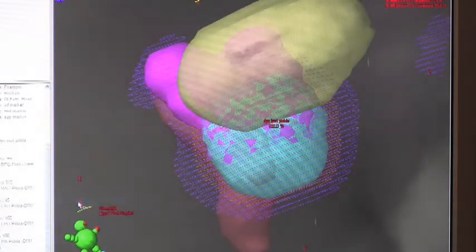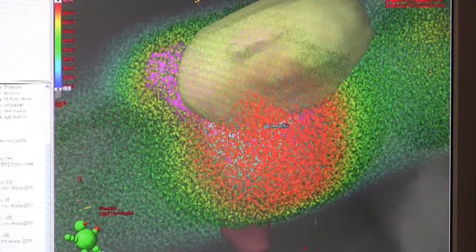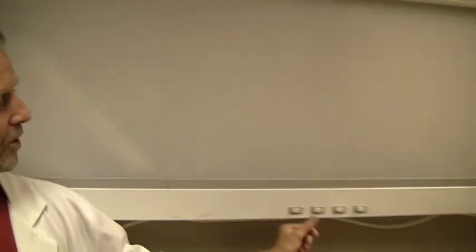Behind us here in this room you will see a view box. This is an antique — well, not truly what might be considered an antique — but this is where I used to hang x-rays up on the board. About five years ago I hung the last x-rays on this view box. The only reason we use it now is to provide a little extra light for the room when we need it.